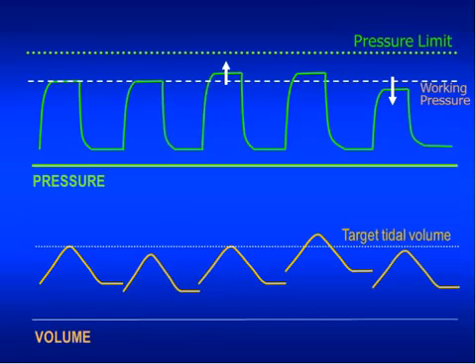But now the tidal volume falls a bit short of our target, and therefore for the next inflation we will have a step up in the inflation pressure. If that results in the tidal volume within a couple of percent of target, no change will occur on the next cycle.